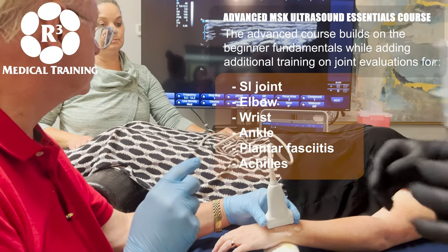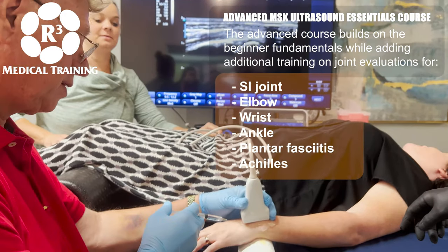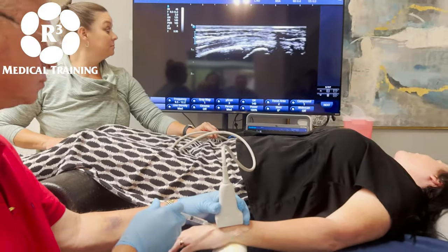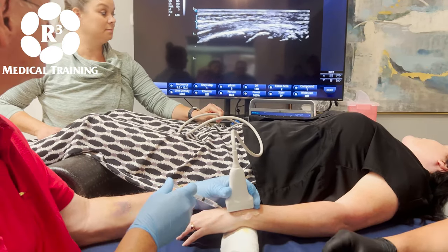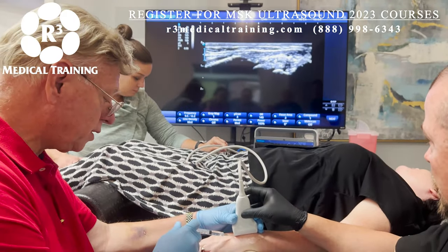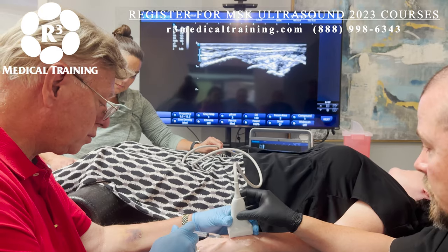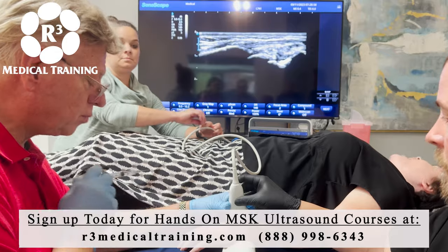That thumb of yours is going to be in your way — sorry, a little sting. The needle is going to be right here, so come back a little steeper. Don't advance, you can just inject in place. Keep injecting there. Okay, there's one cc — go ahead and come all the way up.